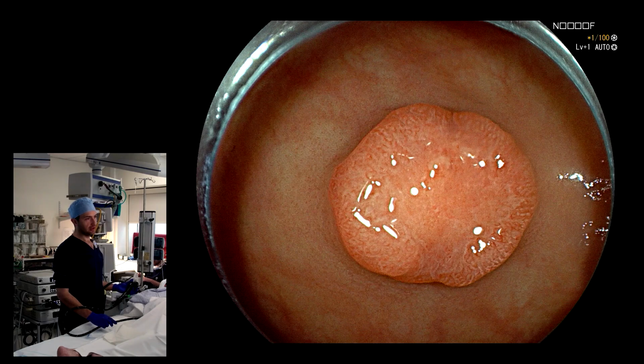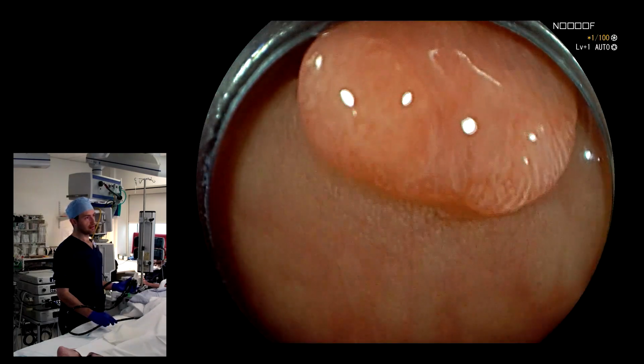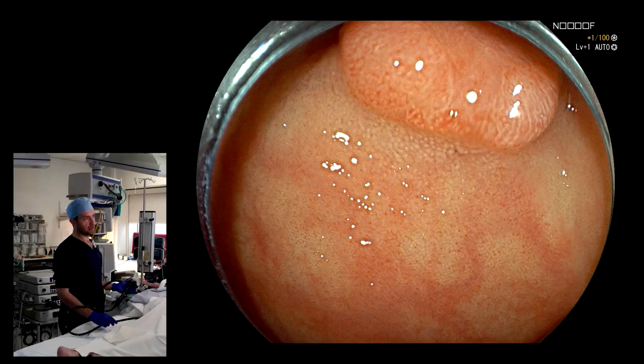It's very clear. There's a little bit of potentially chicken skin mucosa around it. Maybe there's a little depression in the center, and it's most certainly a little more red in the center than around the outside. There's also this kind of feeling maybe that there is a demarcation line right around the edge of this polyp. So as we go closer, there's by the way a nice view of the chicken skin mucosa on the edge of this polyp.